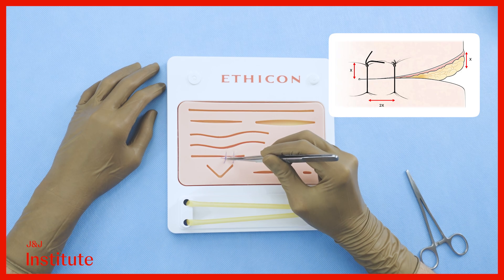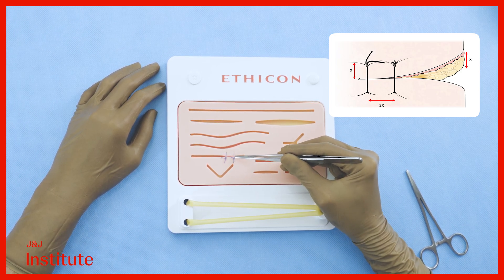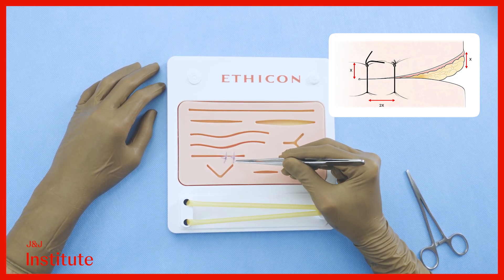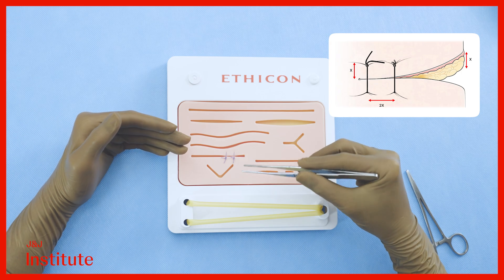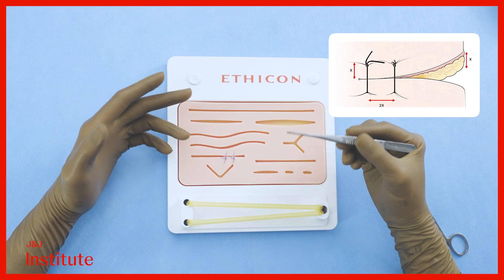The adjacent suture should be taken at twice this distance away from the previous one. When knotting, remember that all knots must lie on one side of the incision and not on the incision itself, which would impair healing. Also remember that we need approximation and not strangulation — some laxity in the suture is needed to accommodate the edema that will surely ensue in the post-operative period.